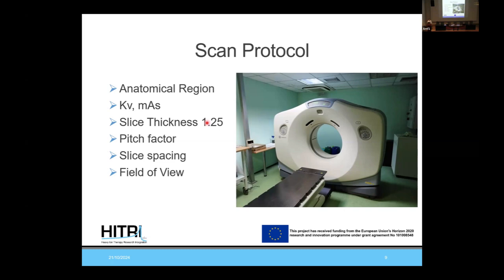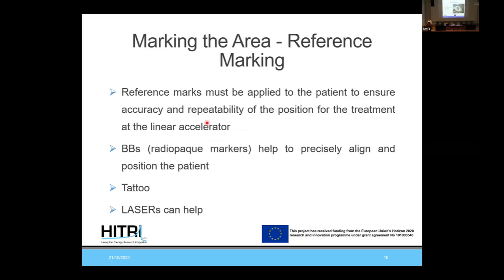Okay, we decide which protocol we are going to use. We are scanning the patient. We are seeing the topogram. After that, we are going to have the images. And okay, the doctor says, it's okay, I'm fine, I like it. It's all the region that I want to have inside.